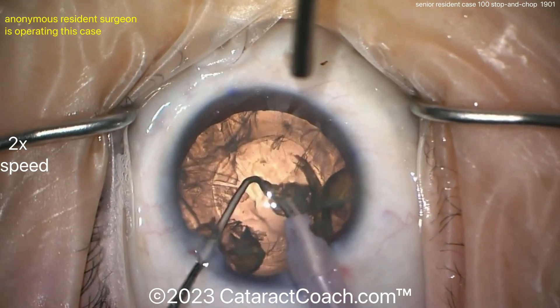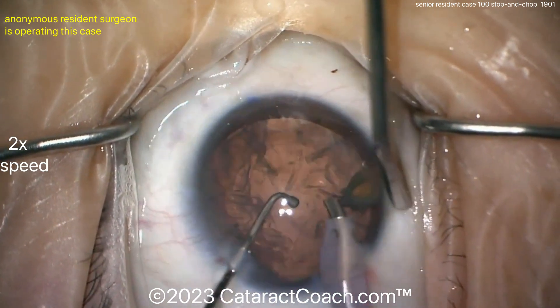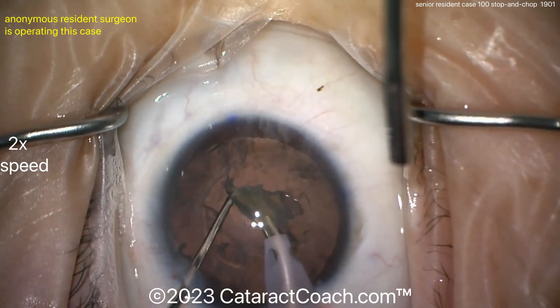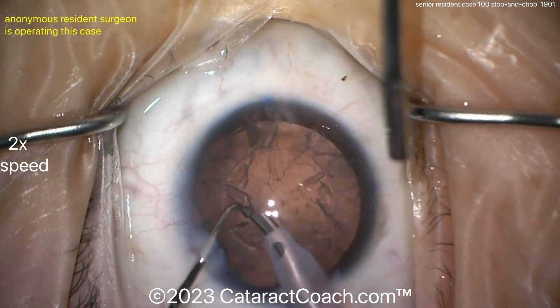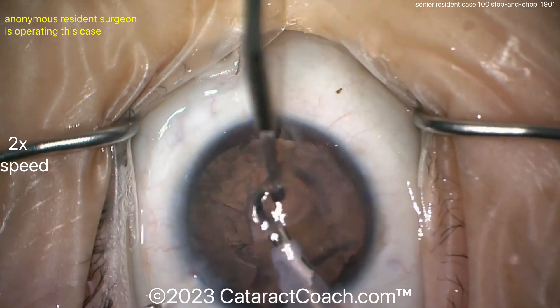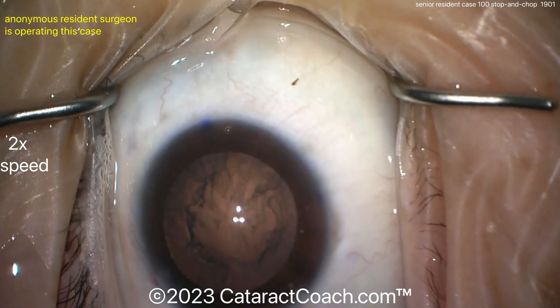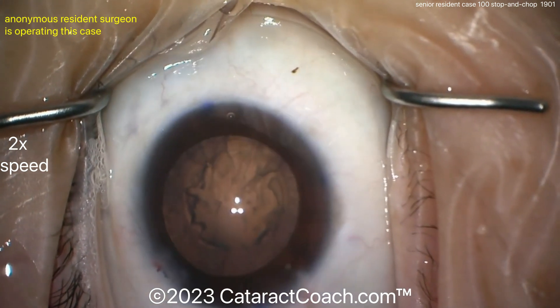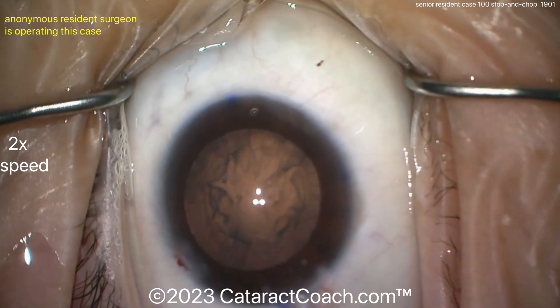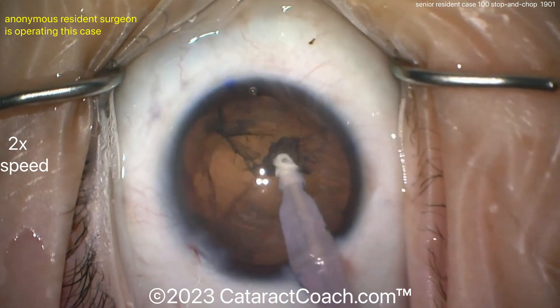Here we go, taking out the pieces — that was very efficient. Remember, we're showing this at 2x speed, so this is not the speed the surgeon is actually operating at. Removing the last bit of nucleus — that goes down pretty easily, beautifully done. If you're in practice and have done 500 cases, this is an excellent level. If you've done 100 and you're this good, I'm really impressed. Keep up the good work — don't take it as too much of a compliment, but as drive and determination to do even better.